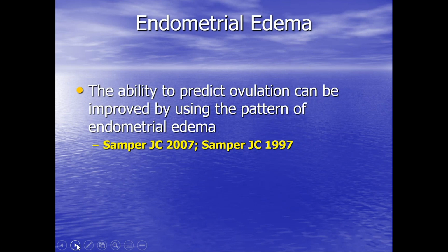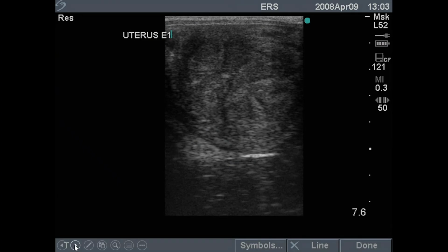And 2007 was really an interesting paper with a different take on the edema subject. It was looking at the endometrial edema pattern in abnormal mares. So I'd encourage you to have a read of those two proceedings, which you should be easily able to get online. I'll try and summarize them and explain how endometrial edema can be used in routine gynecology.